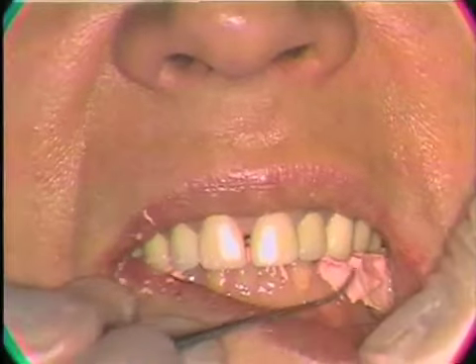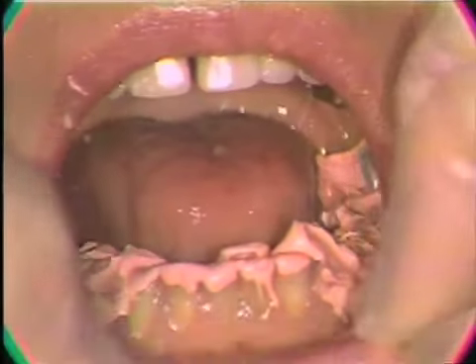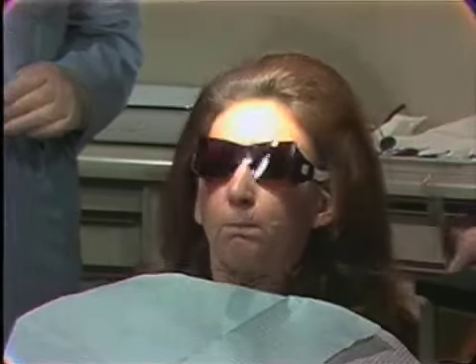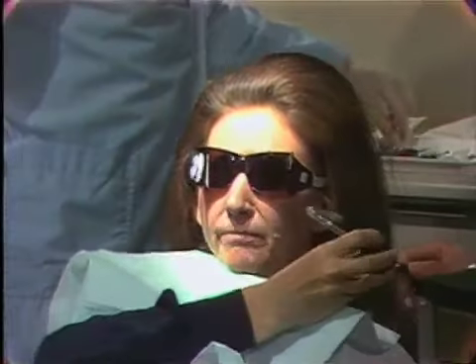To check and see if the material is set, you can use a sharp instrument and see if the material is hard, and then you need to have the patient open, please. Now, to get the final set and to make the material real hard, have the patient rinse out a couple of times with some real cold water. Would you go ahead and take a sip of that water? And the cold water makes the material set even harder than it would be. Okay. Put your head back, please.